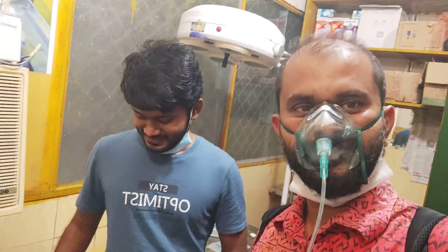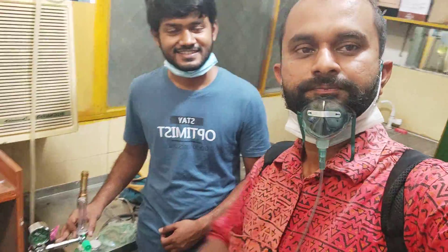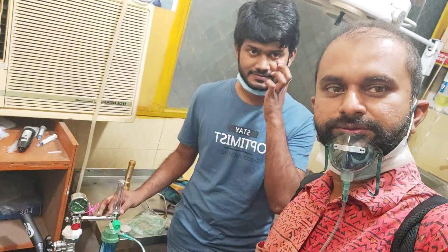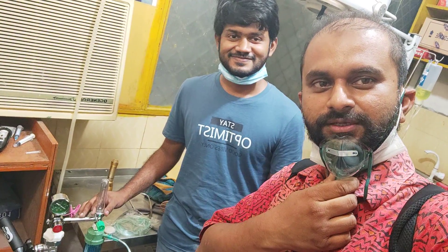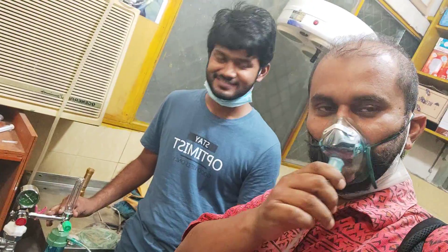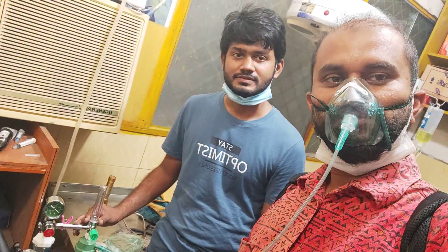I will see that the oxygen cylinder is working. We will be using the animal as well. We will arrange these devices as well.